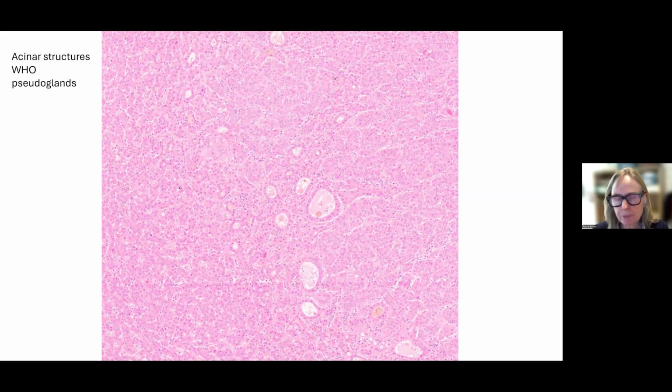And out of context, you could look at that tissue, I think, and be forgiven for thinking about an adenoma, but it clearly isn't, because the patient's got cirrhosis, and we're pretty confident about that in the broader clinical scenario. But the reticulin deficiency, I feel in this case, is convincing. There was also a slightly elevated proliferation fraction, which I didn't show you. And so my conclusion was, I think this is a well-differentiated hepatocellular carcinoma, based predominantly on that reticulin loss. So again, a tricky case just to illustrate how difficult it can sometimes be, but how important the context is when you're looking at well-differentiated hepatocellular lesions and you've got a benign lesion in your differential diagnosis.